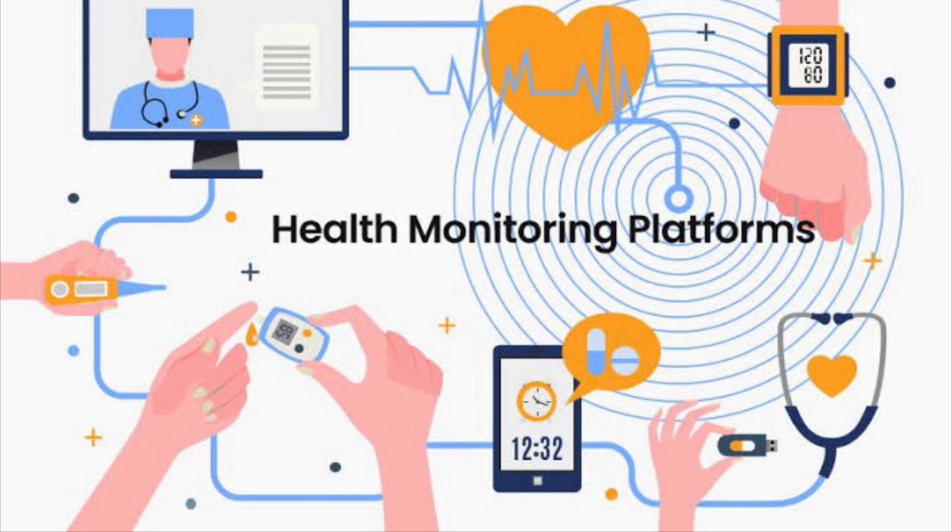Now when you compare this with intermittent vital signs monitoring, which is the practice in most hospitals, where nurses go to the patient's room intermittently, like every 4 hours, and check the vitals manually, this has its own benefits and demerits. The benefit naturally is that the nurse compulsorily will go and visit the patient every 4 hours. In addition to the vital signs checking, this will lead to an interaction between the patient and the nurse, and if there is any other concern that needs to be addressed or discussed, that will happen during this vital signs monitoring. It will help to establish a rapport between the patient and the nurse.